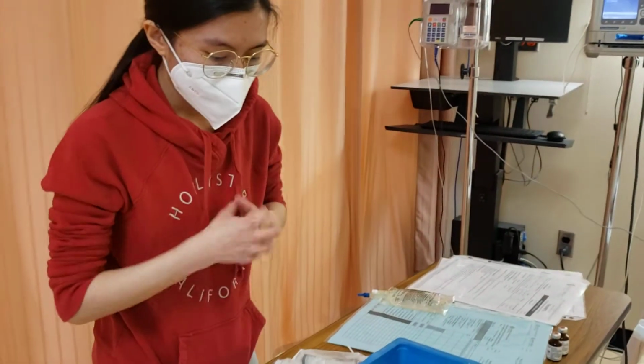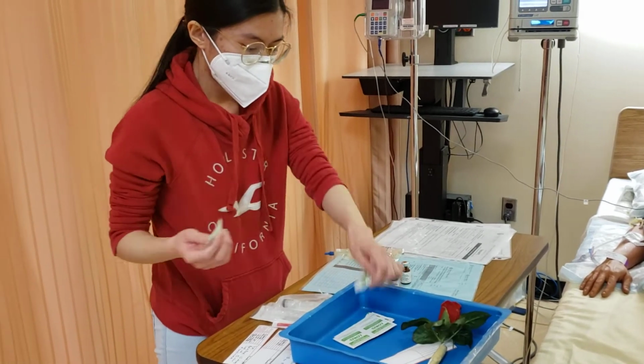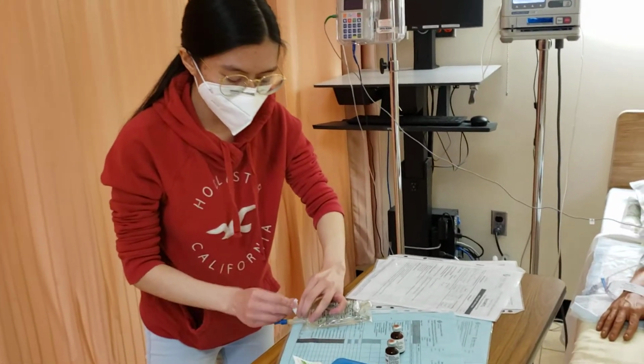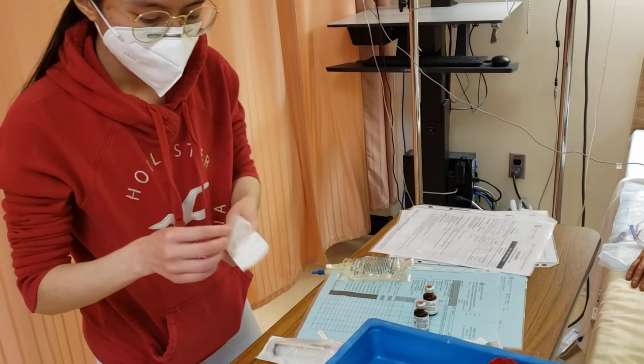Okay, so I will prepare my medications. I would do hand hygiene for 30 seconds.